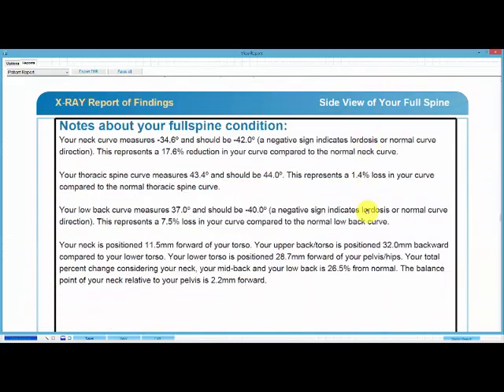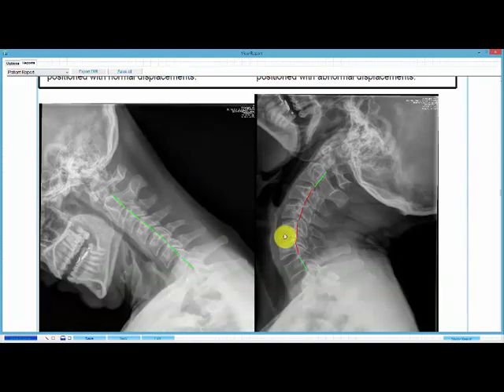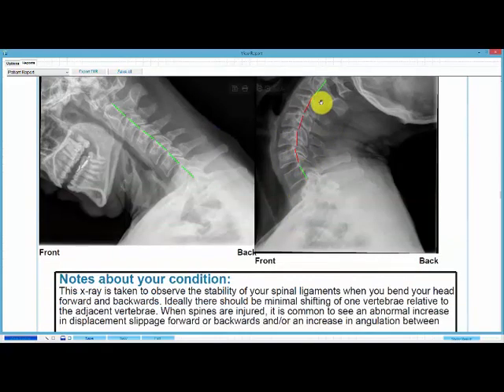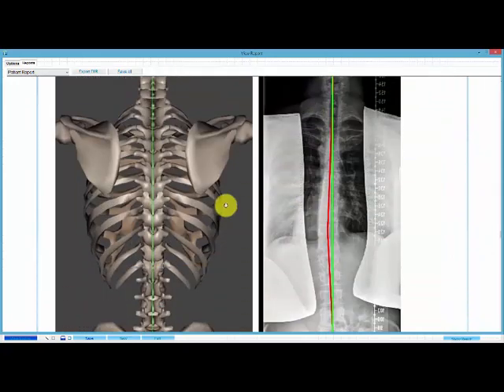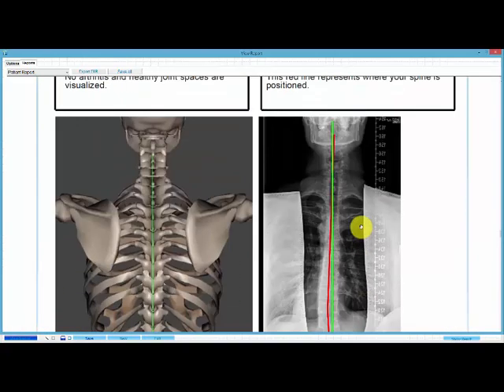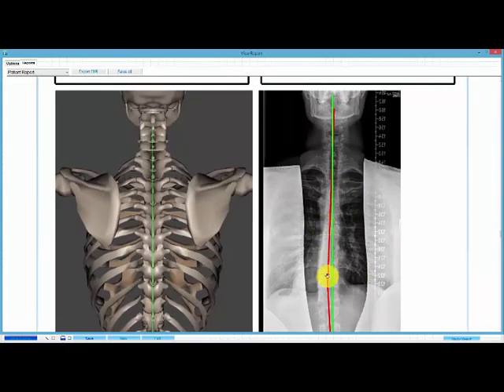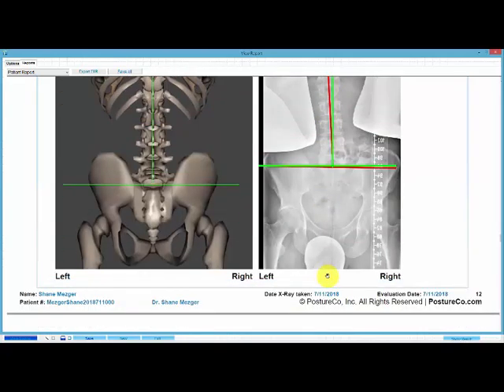Scrolling down, we see a normal full spine on the left and my spine on the right. My thoracic spine curve measures 43 degrees — it should be 44 — just a 1.4% loss. My low back curve measures 37 degrees — it should be 40 — only a 7.5% loss. Because I've got good curves in my spine, I've had relatively minimal issues with my low back, other than the disc in my neck confirmed on x-ray. On the AP view, the ideal model shows the spine perfectly straight, but I bow out to the left. My goal is to correct this over the next six months to minimize the risk of future issues.